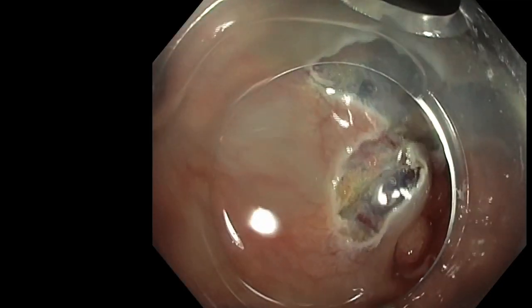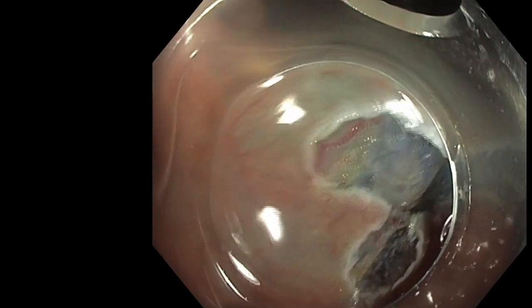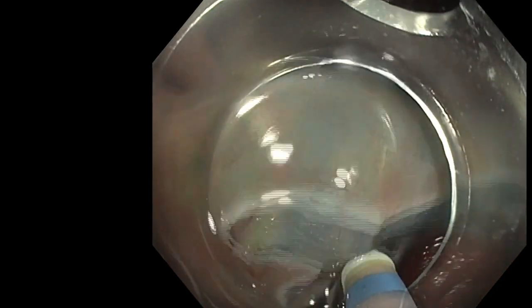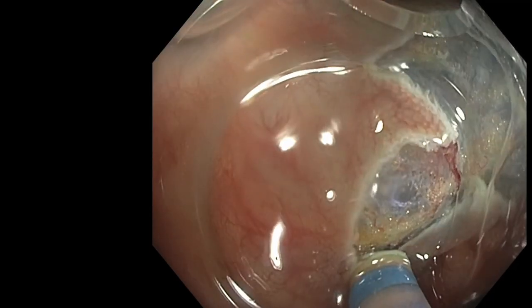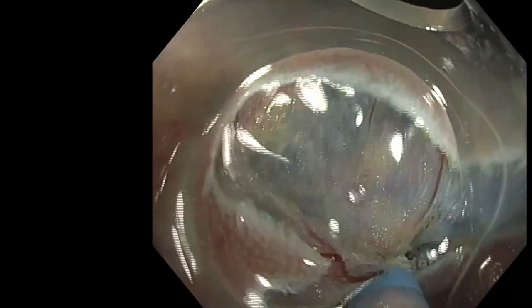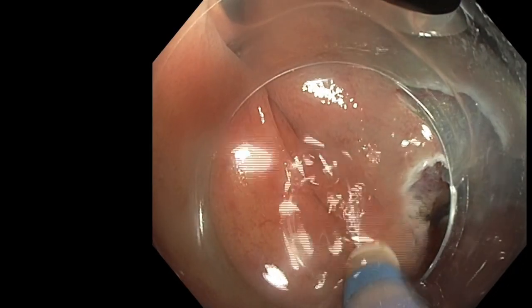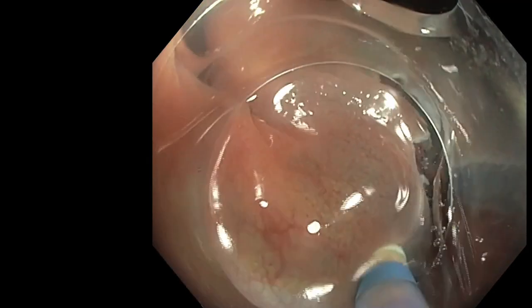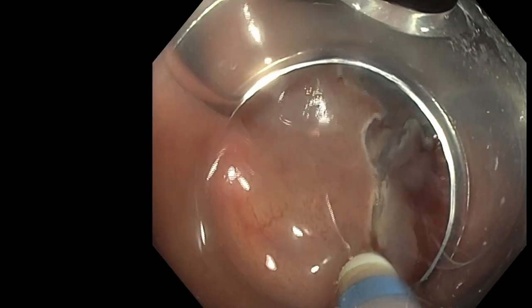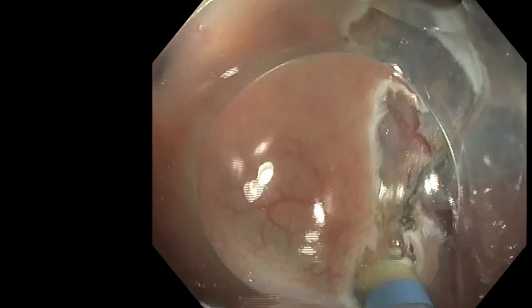And immediately after each incision, I try to have a good trimming in order to open the space and prepare my later ESD all around the lesion. Once again, in this strategy, we want to turn around the diverticula in order to leave the diverticula for the end, getting the more pressure from the traction, the more traction on the last fibers into the diverticula, and not spending this traction on the normal submucosa around the diverticula.